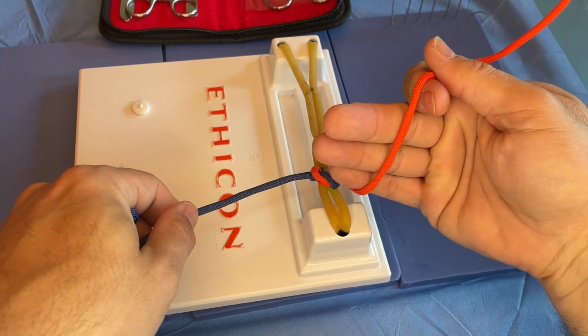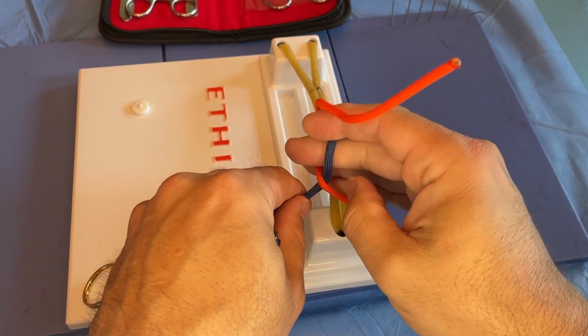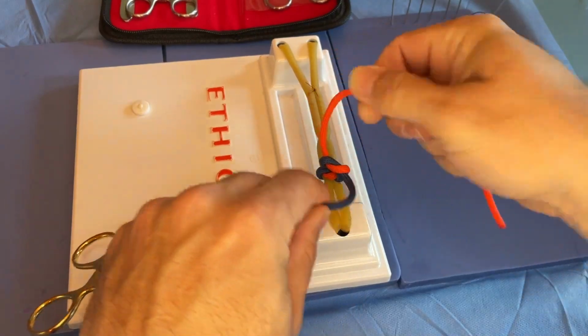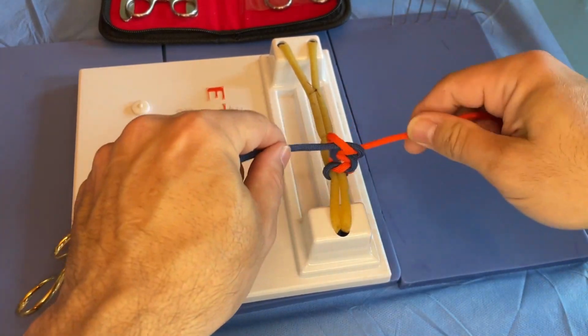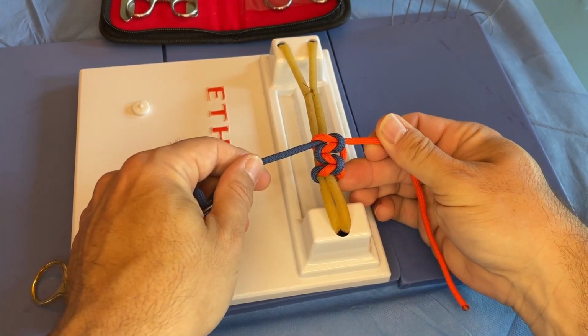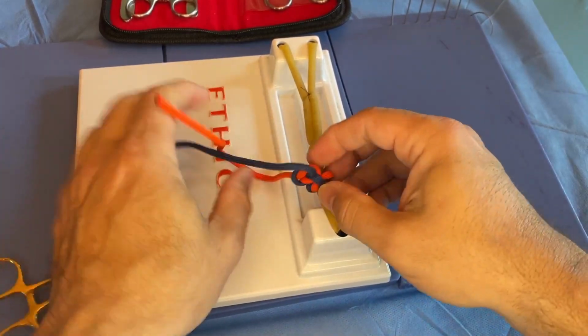So again, over the 3 fingers, create the loop, use your middle finger to pull it through, do that. Then over index finger, flip it through and do that. And again, you can see that we're laying down nice, consistent square knots there. So nice simple overview for one-handed, two-handed throws.